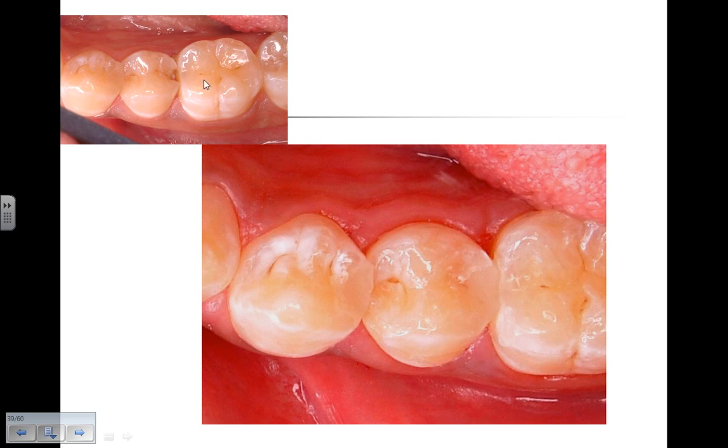On the upper left-hand side, we see the preoperative view of the fractured marginal ridge in number 20 distal, and then the surface restored. It's not unusual, because you can't physically carve composite well, that the contact is usually broader than what we typically see with a natural tooth.